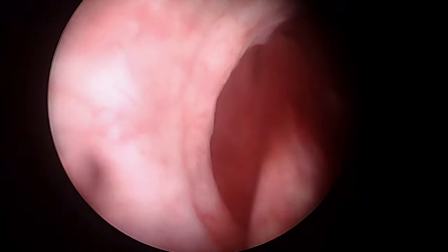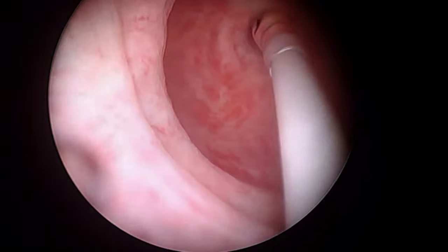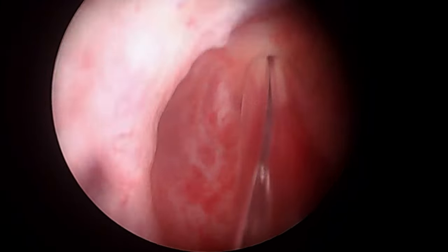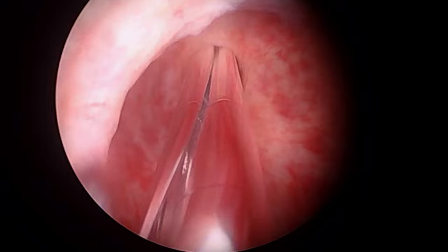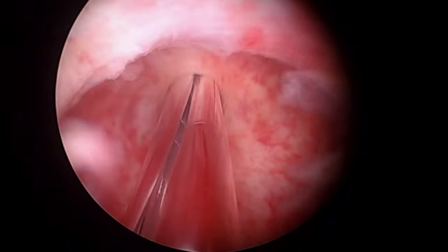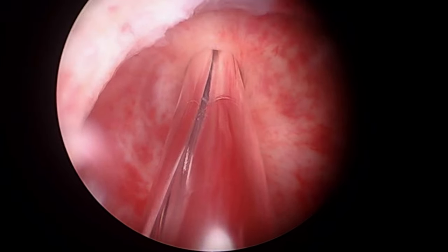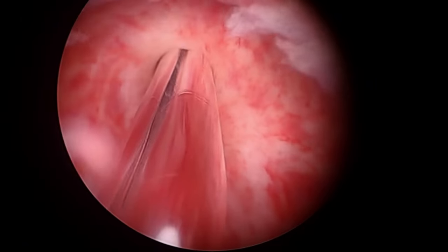we introduce the balloon dilator that goes over the wire, and then we center that balloon dilator around the middle part of the stricture and inflate the balloon. That process of inflation is going to dilate that area so that the area is open and we can go in with a scope and get inside the bladder. What you will see next is the inflation of the balloon to dilate the area of the stricture.